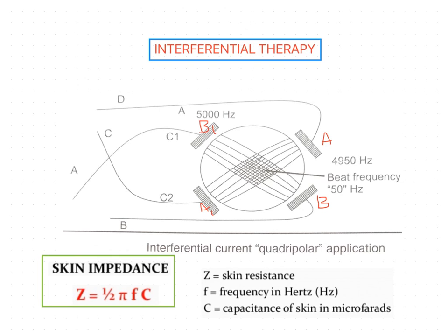Okay, so I have already explained about interferential currents in the therapeutic currents. Now, in this session, we are going to discuss how the therapy is given by these interferential currents, and what are the indications and the physiological effects of the interferential therapy.